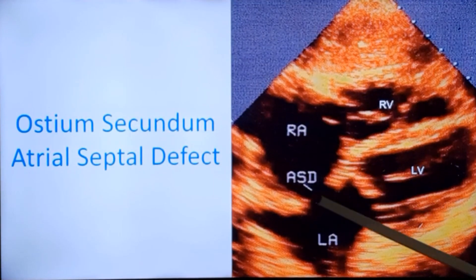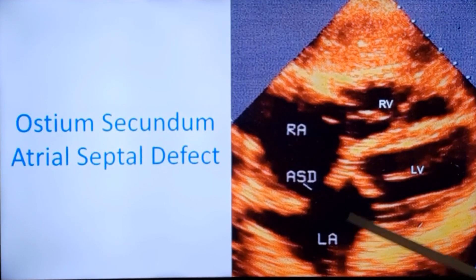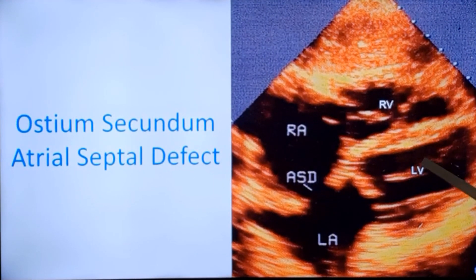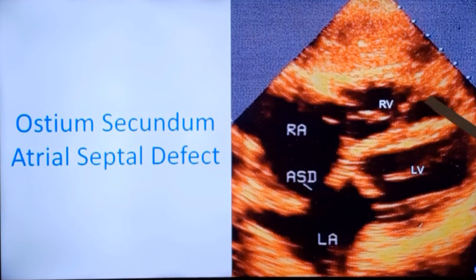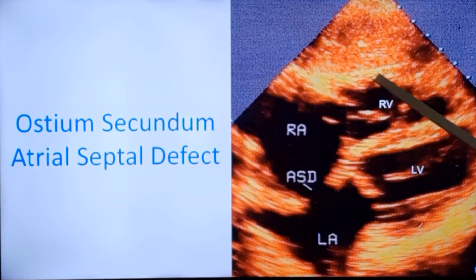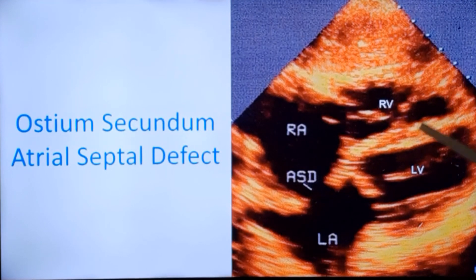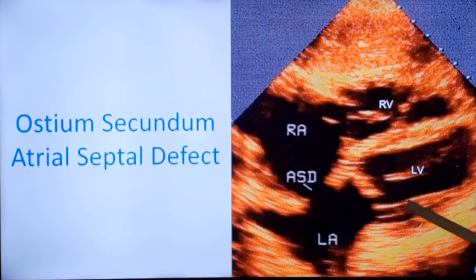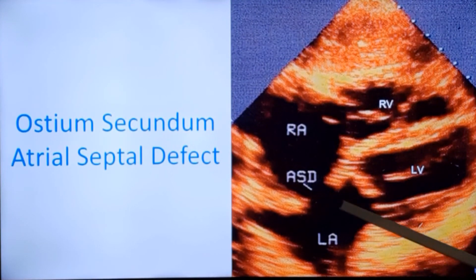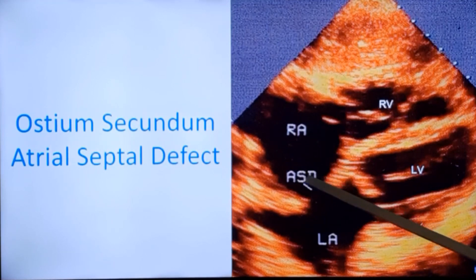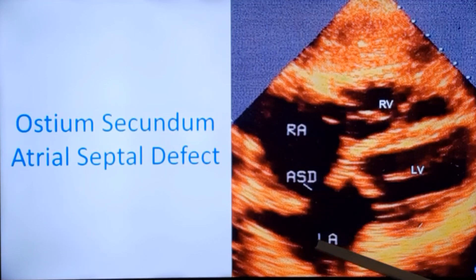This is the right atrium, left atrium, left ventricle, interventricular septum, right ventricle, and this is the right ventricular free wall. This will be the left ventricular wall, and this is the atrial septal defect — secundum atrial septal defect.